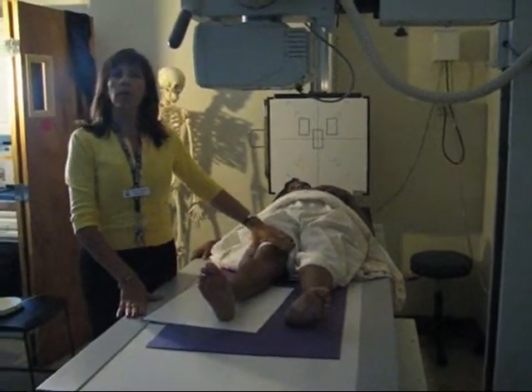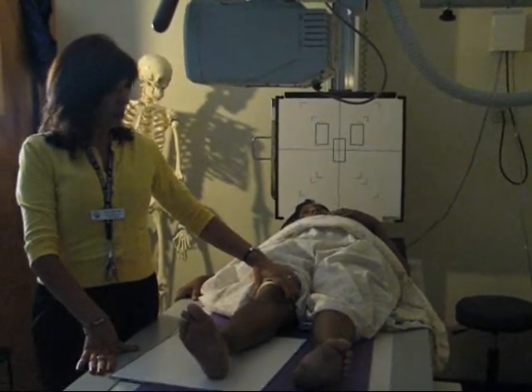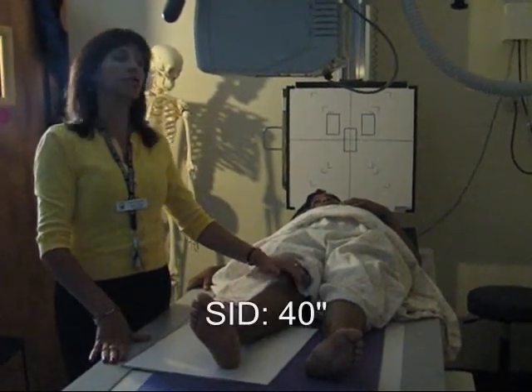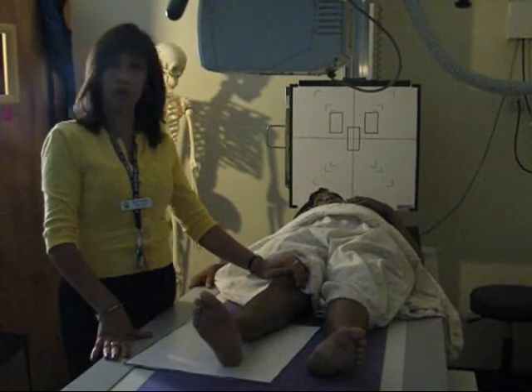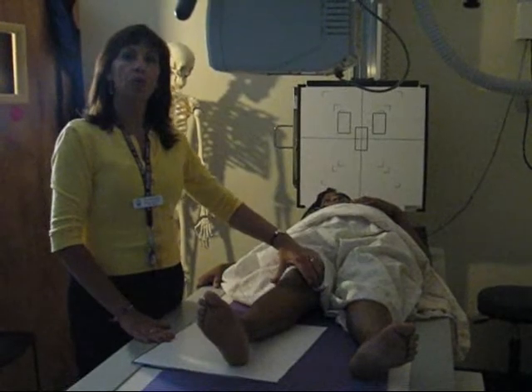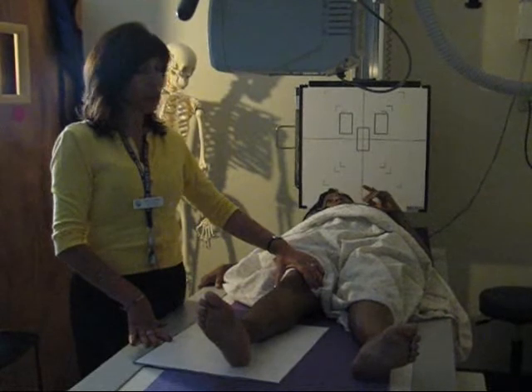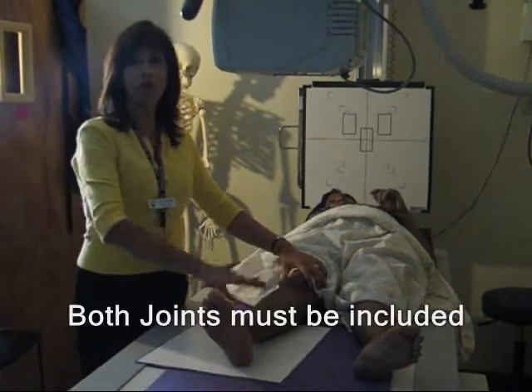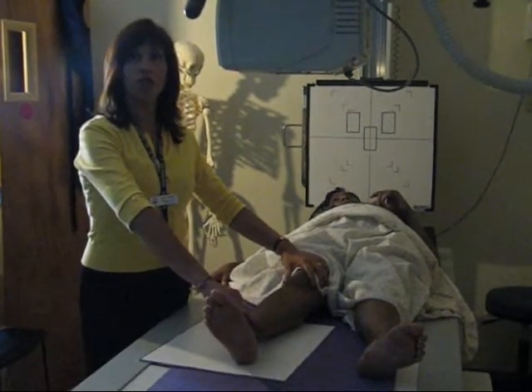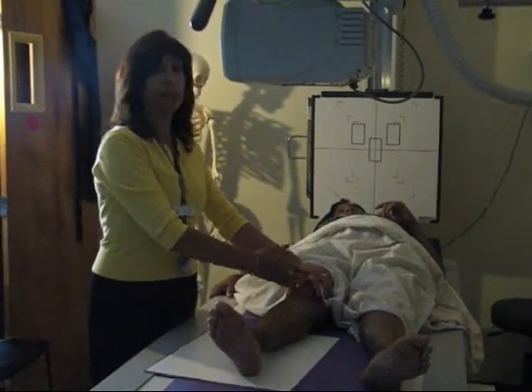We are now going on with our lower extremity and our tib-fib projection. There are several considerations to have when you x-ray a long bone like the tib-fib. Every time you have to do an x-ray of a long bone, you want to always include both joints the bone attaches to. So somehow you're going to have to show the radiologist the ankle joint and the knee joint.